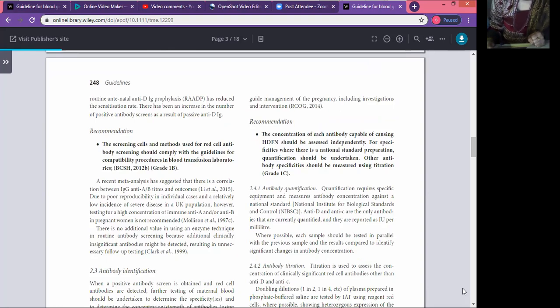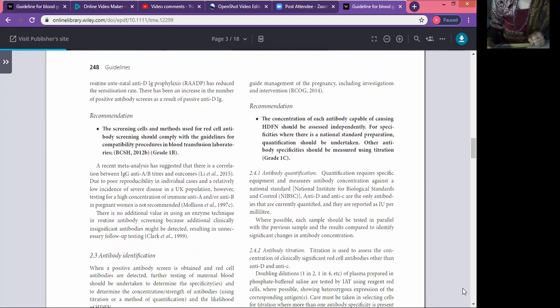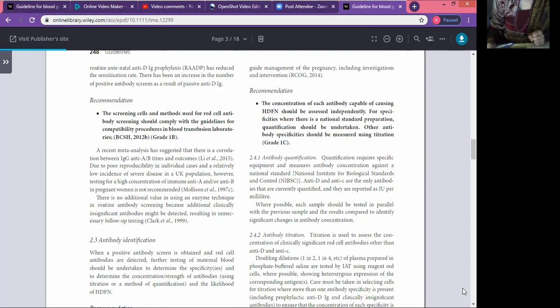And then also, regarding the antibody administration, four things need to be updated there: the dose and the date of administration, and also the route and the reason for administration of anti-D. If anti-D prophylaxis had been administered, then that would of course affect the results of the D testing. So this should also be stated on the form. So regarding anti-D administration, we should ask these four pertinent questions.